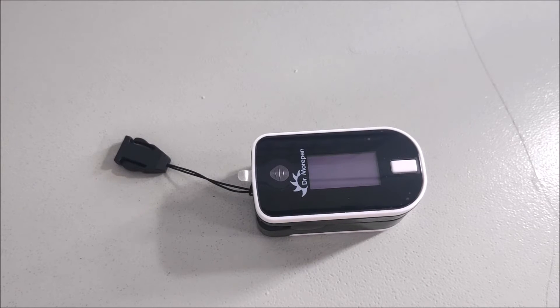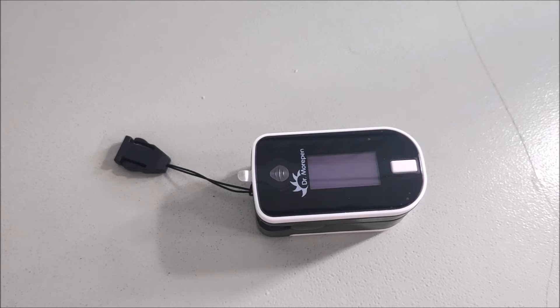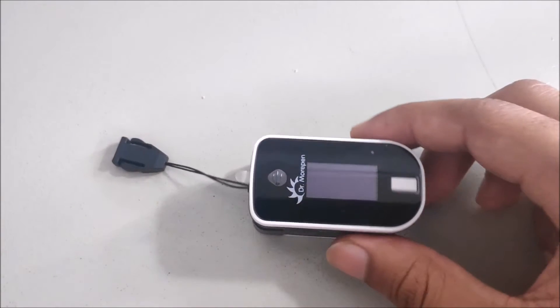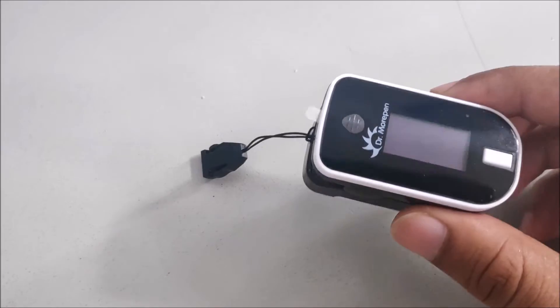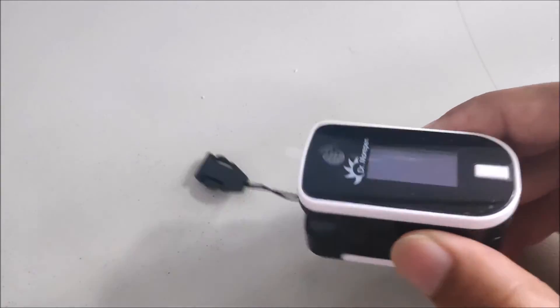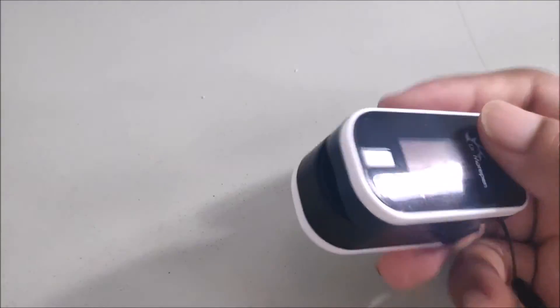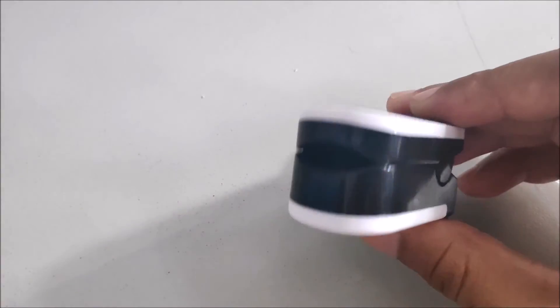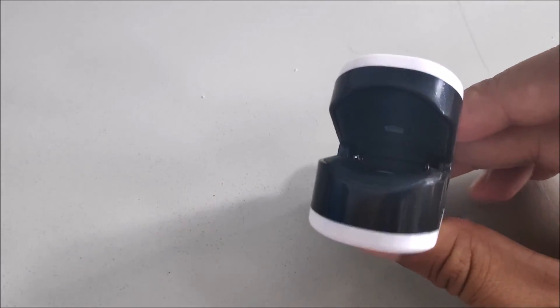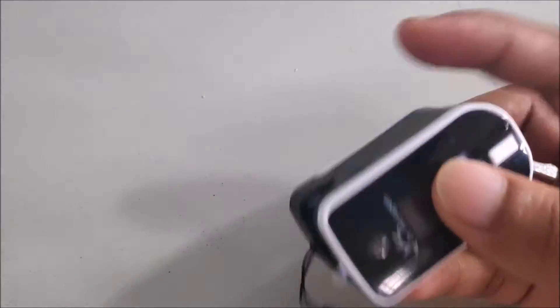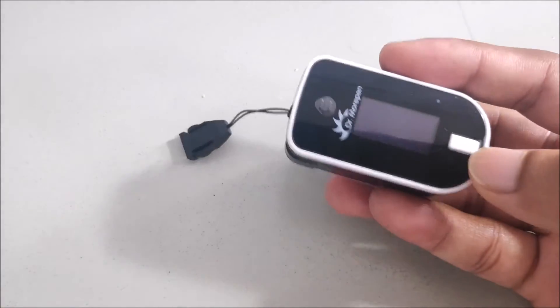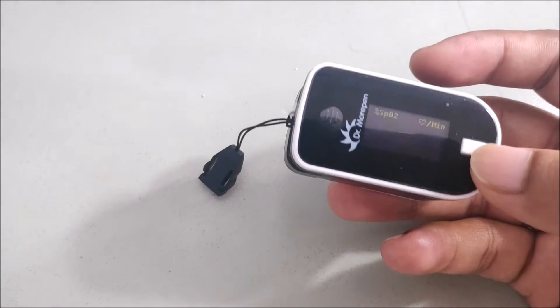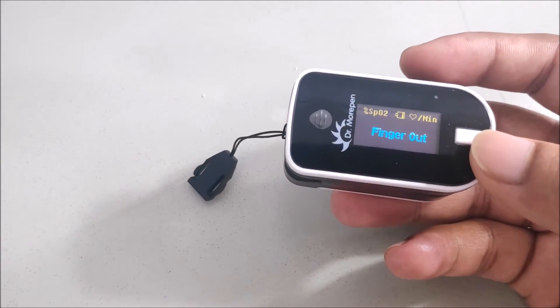This is a pulse oximeter I am having - a small device which is a clip-on finger pulse oximeter. It has one button on the interface and opens this way.